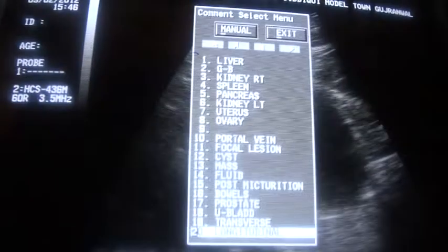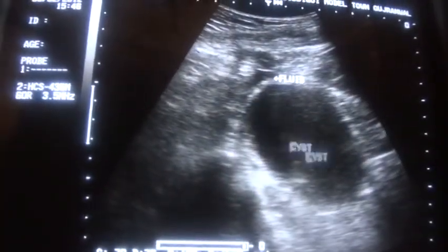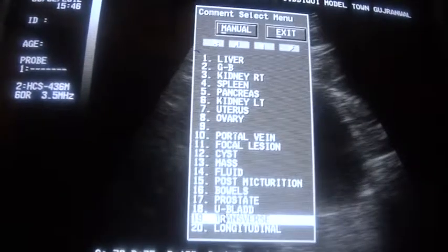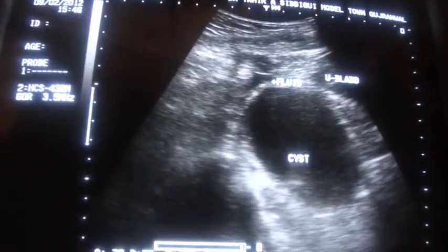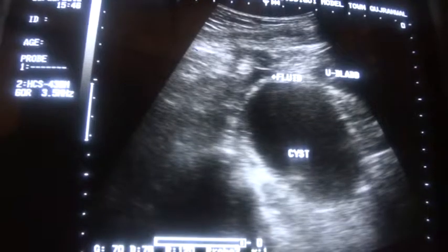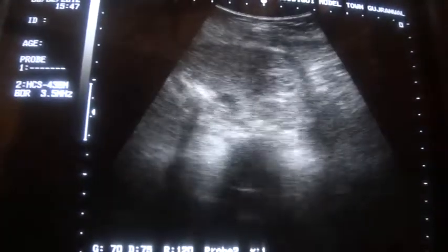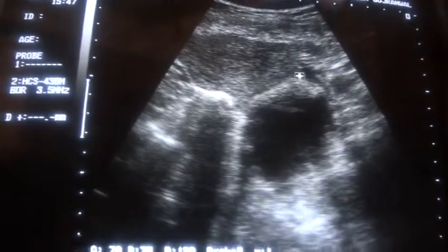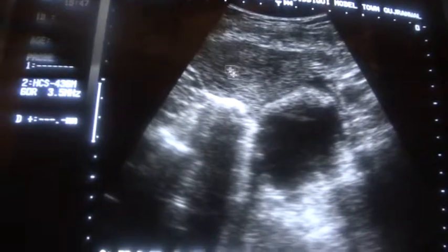This is your cyst. This is the uterus in transverse section, and here again you can see this is fluid, this is the cyst, and this is the uterus.